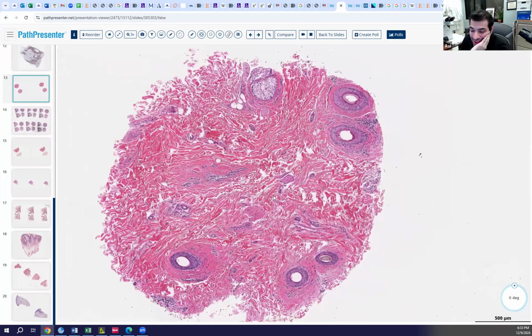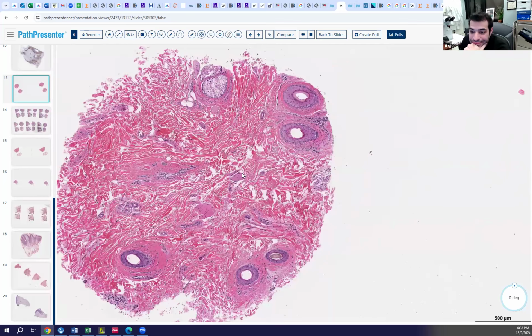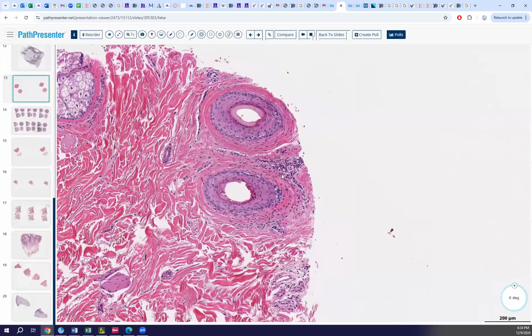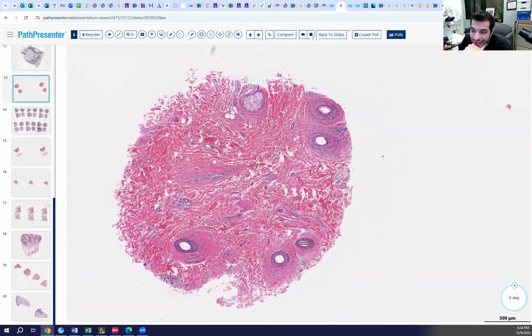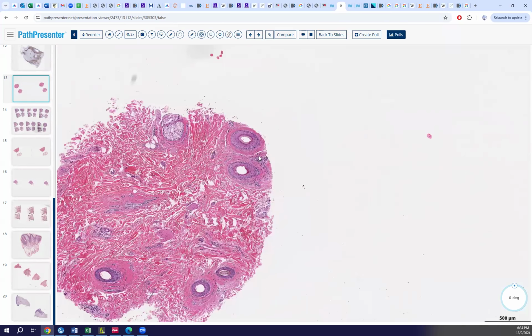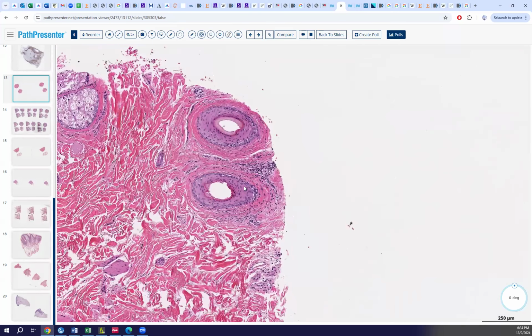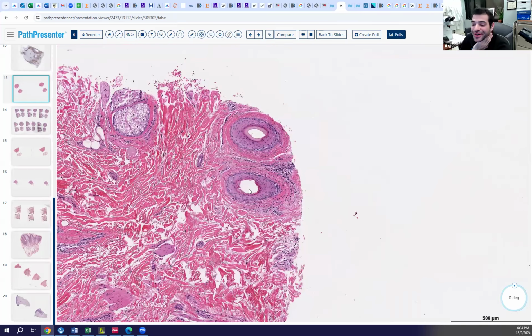Okay, so we have an idea of what level we are. What else do we know? It looks like the hair density itself is pretty diminished, as well as the actual hair. In this area, there's a diminution. And the hair follicles themselves are miniaturized. The actual width is small. There's a more striking feature here.